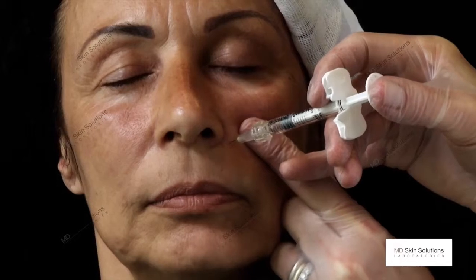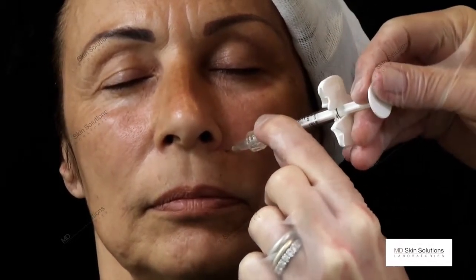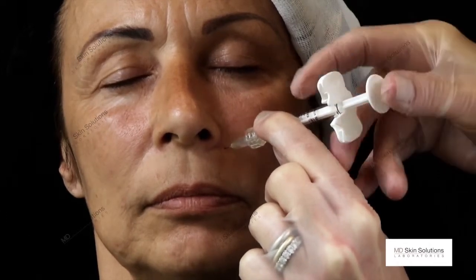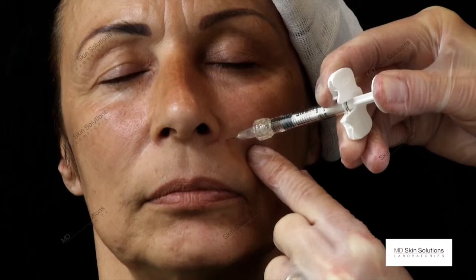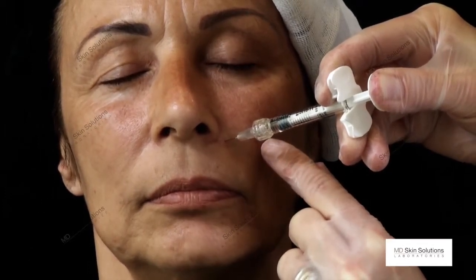I do touch the bone, aspirate, touch the bone, withdraw the needle, aspirate, and then 0.1. See how it lifts up immediately.